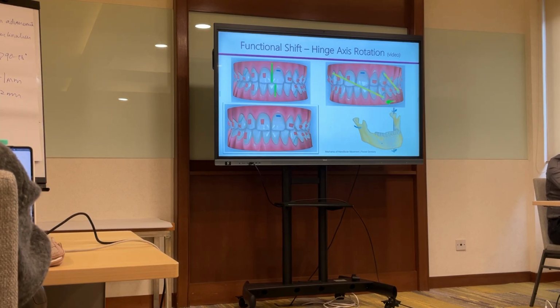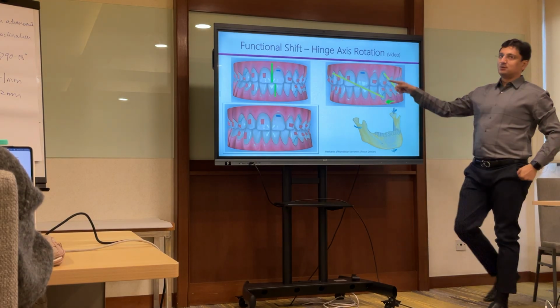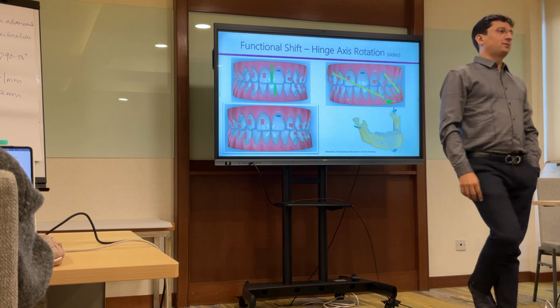Show me your seminar 2 work. The inspection. In your kit, you have a tool. You have a kit. Did you see that kit? It's a very nice mold, and you just have to fill composite. Otherwise, what's your second option you have for this? You have to put a metal button.